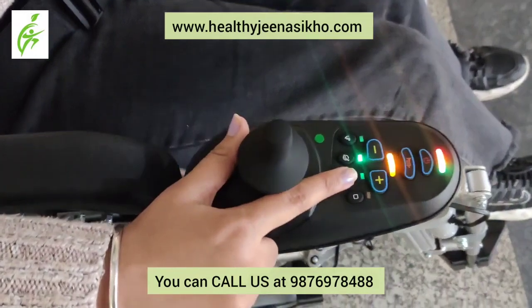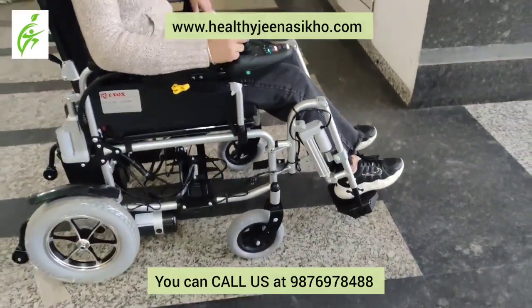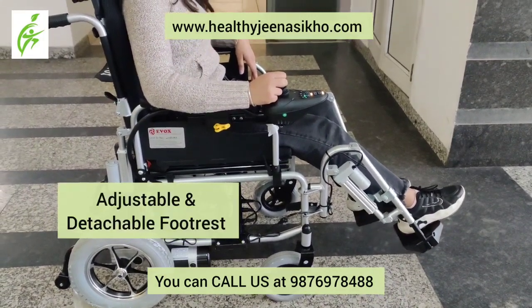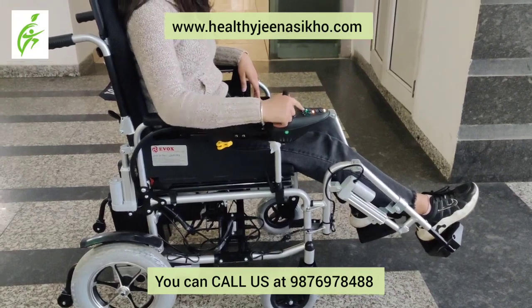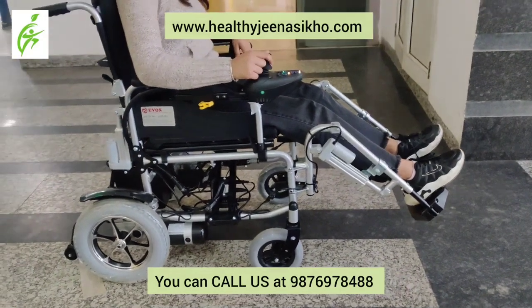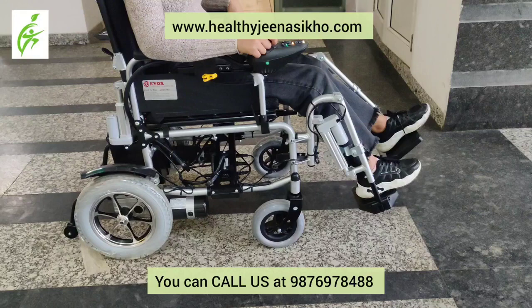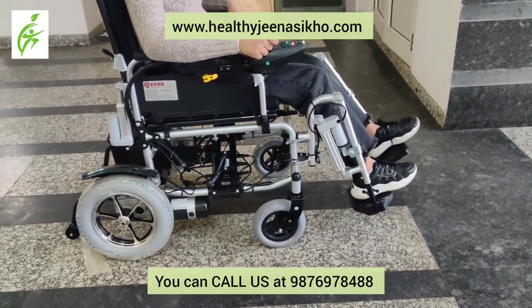The footrest is very comfortable. You can move it on both sides and adjust it to any angle you want.